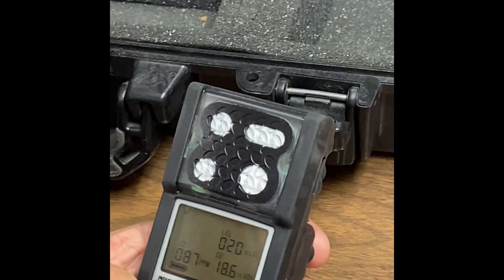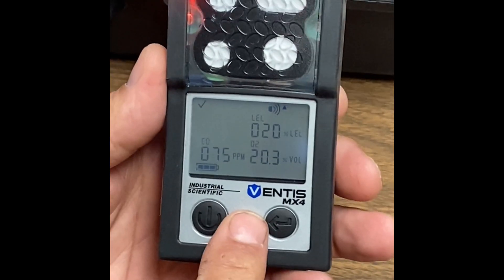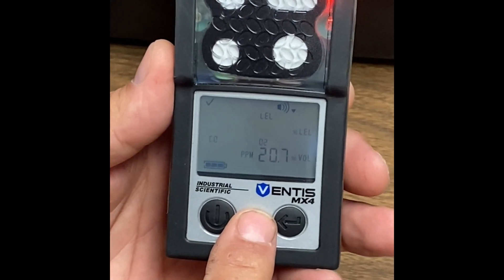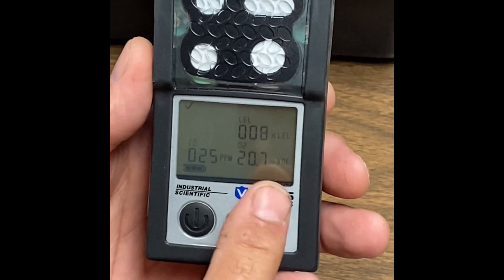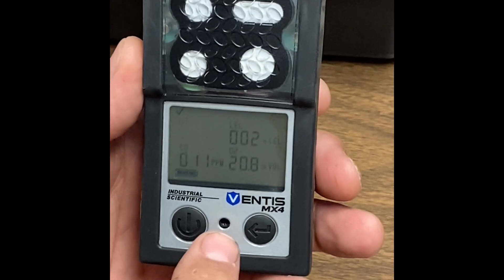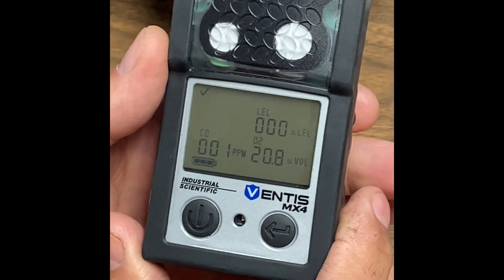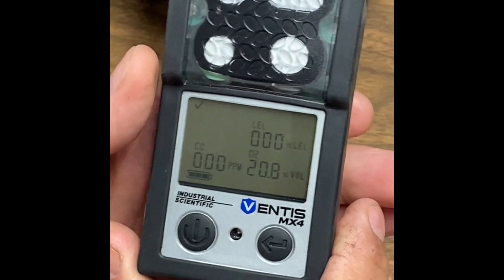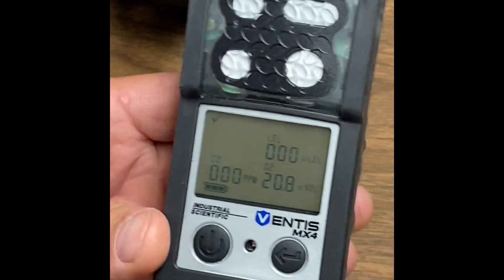You can go ahead and turn your gas off and let your monitor zero itself out. You should see zero, zero, and then somewhere right around 20.9, 20.8. And at that point, technically you're ready to utilize the gas monitor.